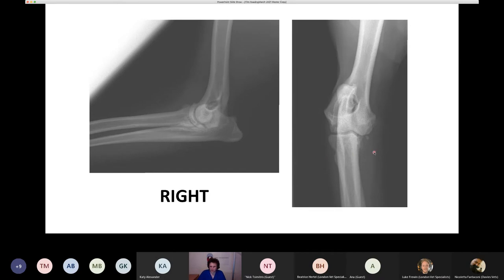And as Bates pointed out, we certainly can see some osteophytes in both elbows. The changes are similar in both, so we'll just stick to the right elbow for now. If we look at the medial part of the right humeral condyle, we can see there's some aberrant bone located just distal to the medial epicondyle. That aberrant bone probably represents a few mature osteophytes.